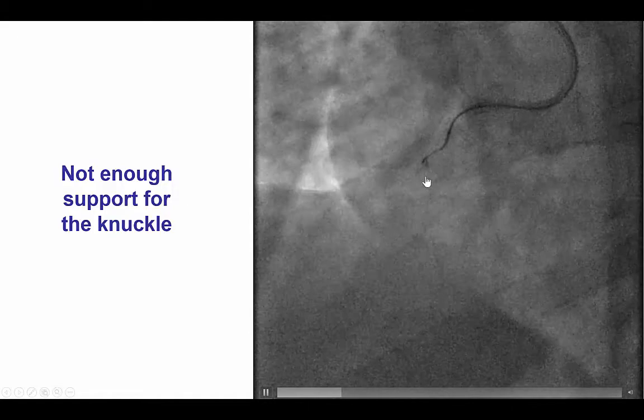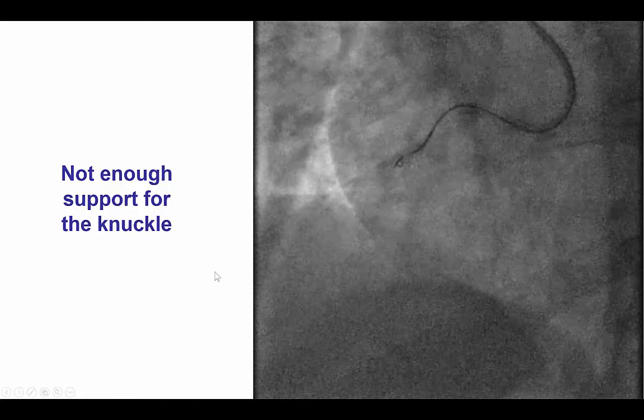We then did additional attempts to cross sub-intimal. However, we had significant difficulty reforming the knuckle a little more proximal of the occlusion.